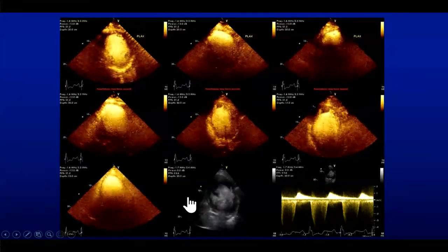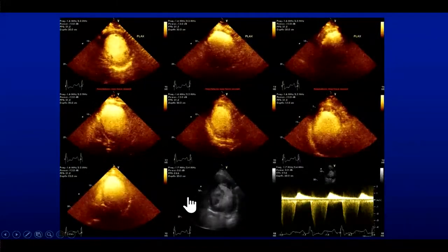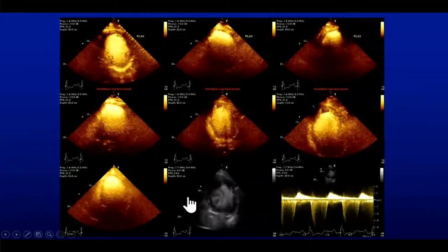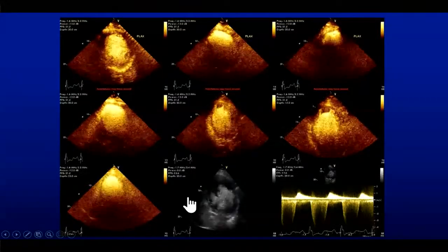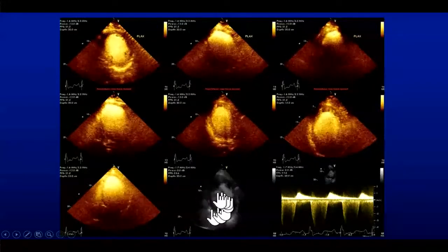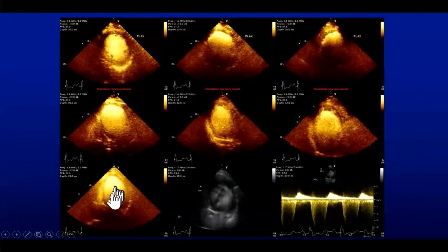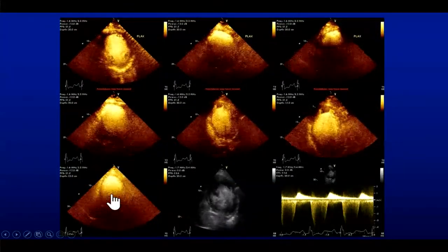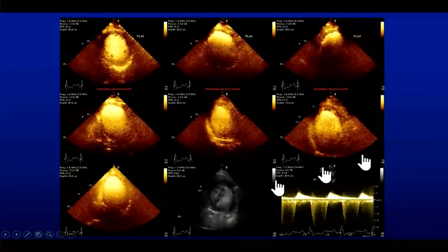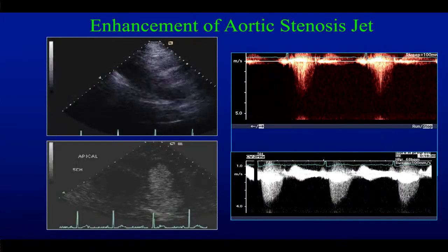They didn't wait that much. Yeah, exactly. So the sonographer said, I'm not going to wait too long. I'm going to increase my mechanical index a little bit, destroy some bubbles, right? Remember this hurricane heart. That's what you see here. Usually, ideally, you should wait, meaning second guess yourself from the first time that the injection was too fast. So next time when you inject, it shouldn't be as fast, right? So this is important. It's a nice summary of what we just described.